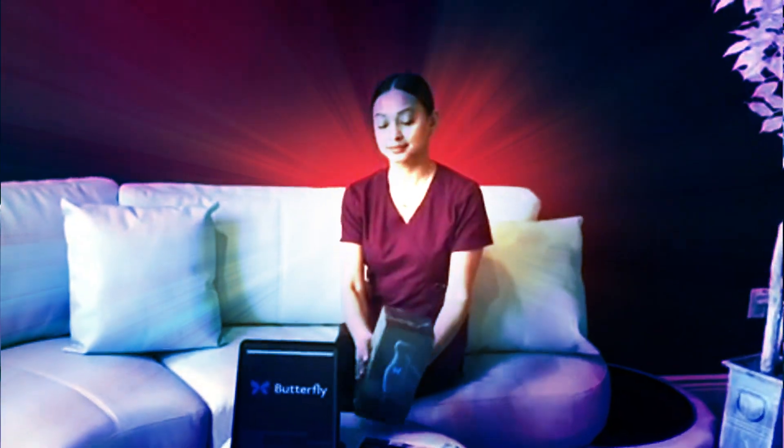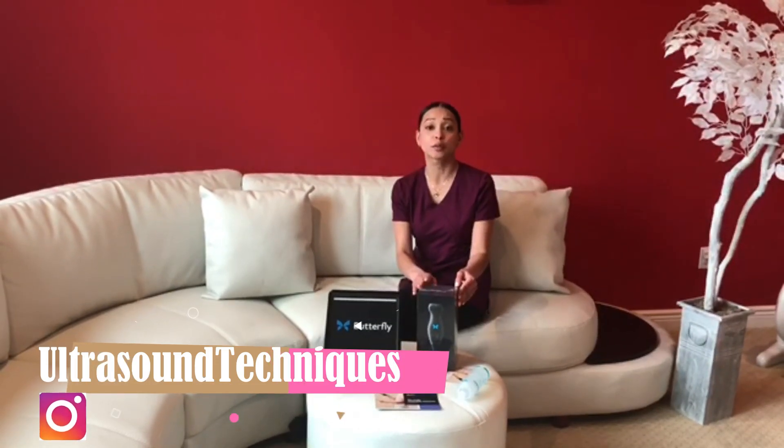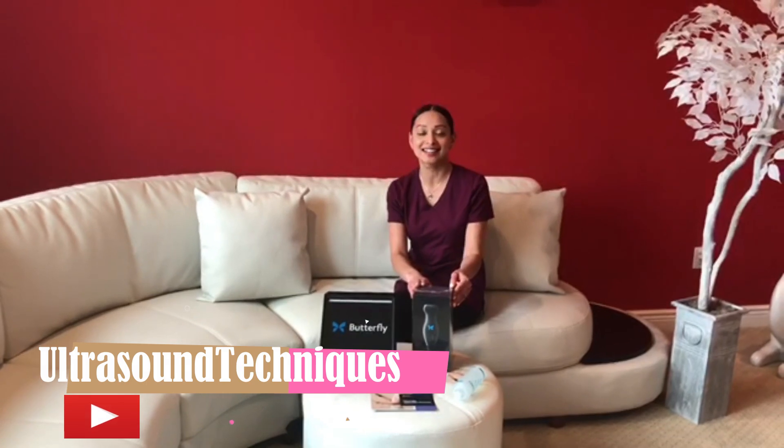Hey everyone, if you follow my page you know I made a life-changing purchase yesterday, which is this Butterfly IQ probe. If you don't follow my page, you should — it's ultrasound techniques on Instagram and of course here on YouTube — to learn more about the probe and ultrasound techniques and how it can help you in your everyday scanning abilities, for doctors, for students, anyone interested in ultrasounds.